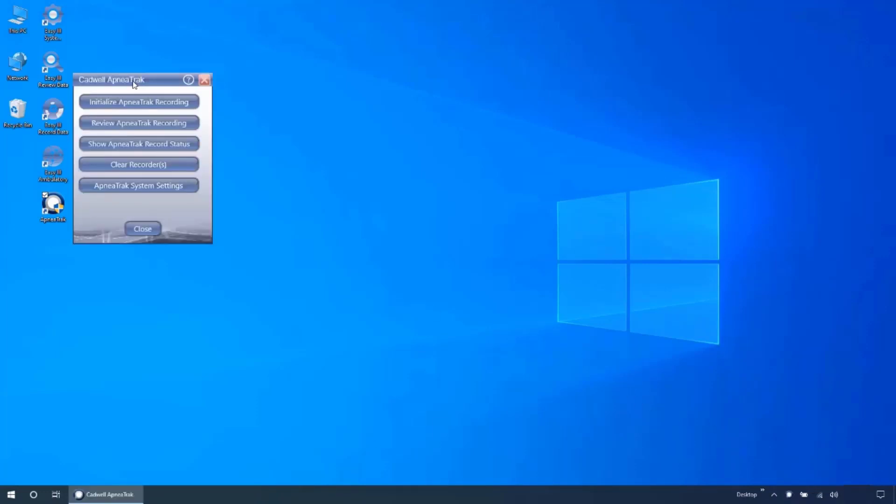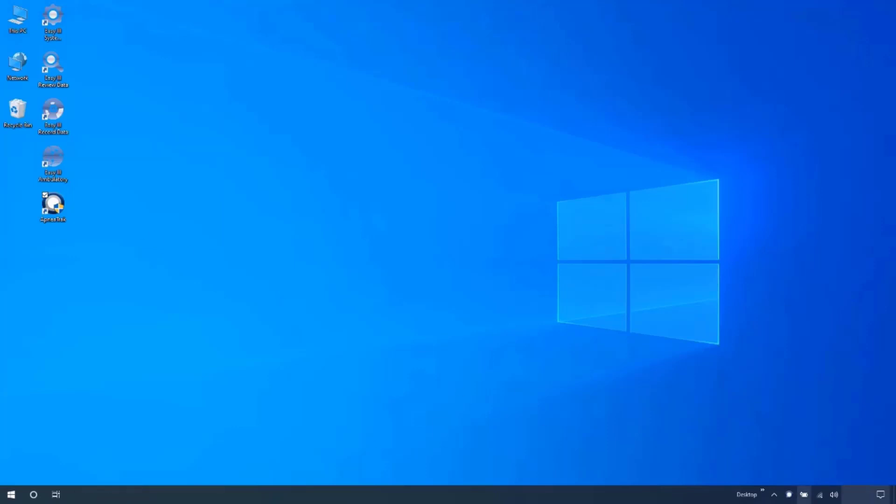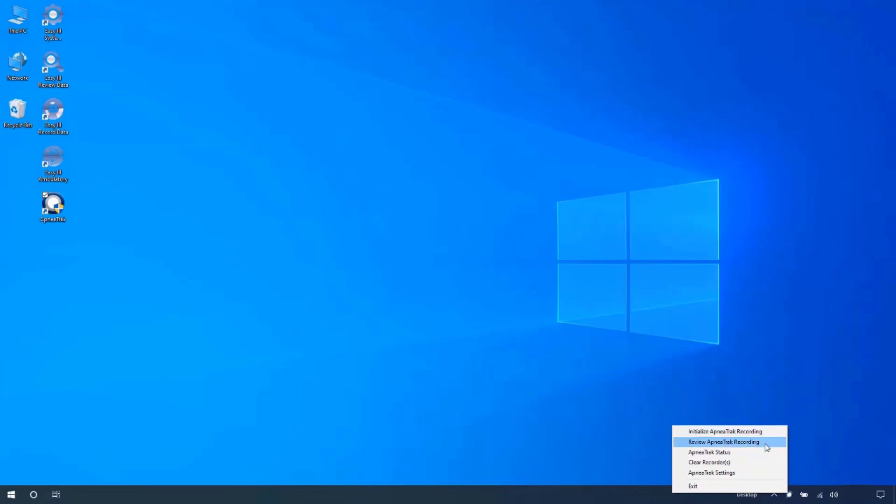This will open a jump menu, giving you access to all the ApneaTrak control screens. You can also right click on the ApneaTrak icon in the system tray for direct access to the initialize, review, status, clear, or settings menus.